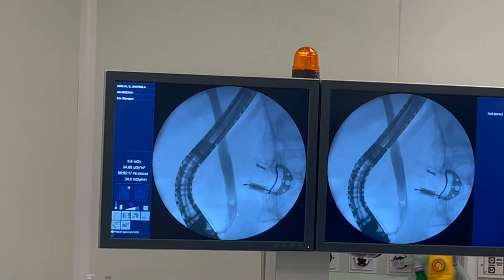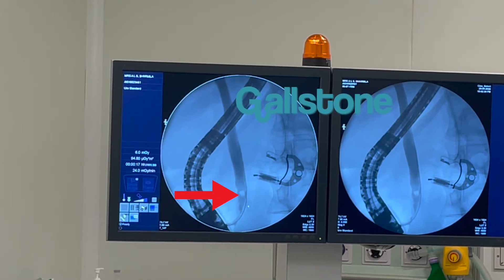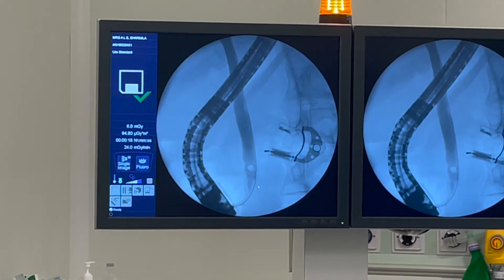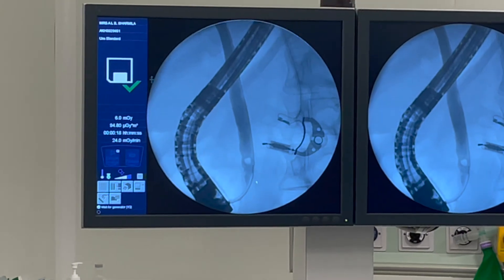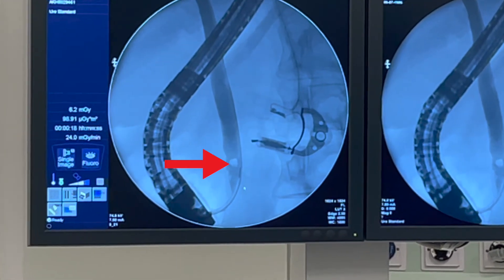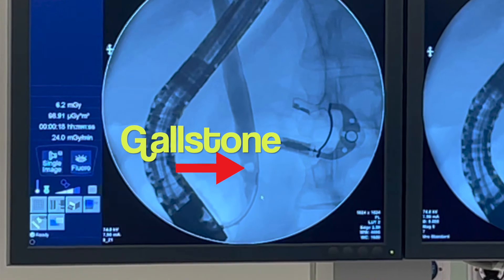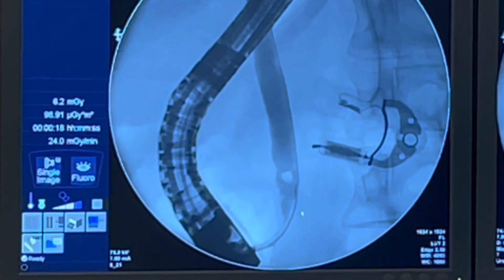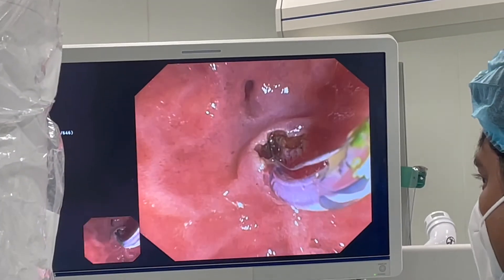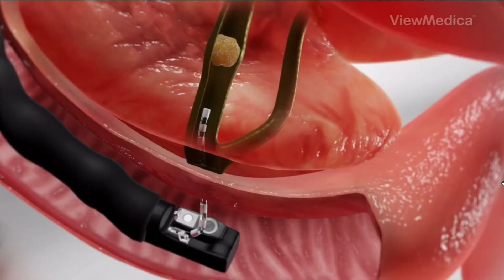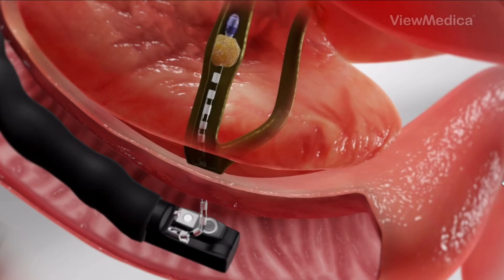The doctor may pass tiny tools through the endoscope to open blocked or narrowed ducts, break up or remove stones, perform a biopsy or remove tumors in the ducts, or insert stents — tiny tubes that a doctor leaves in narrowed ducts to hold them open. A doctor may also insert temporary stents to stop bile leaks that can occur after gallbladder surgery.